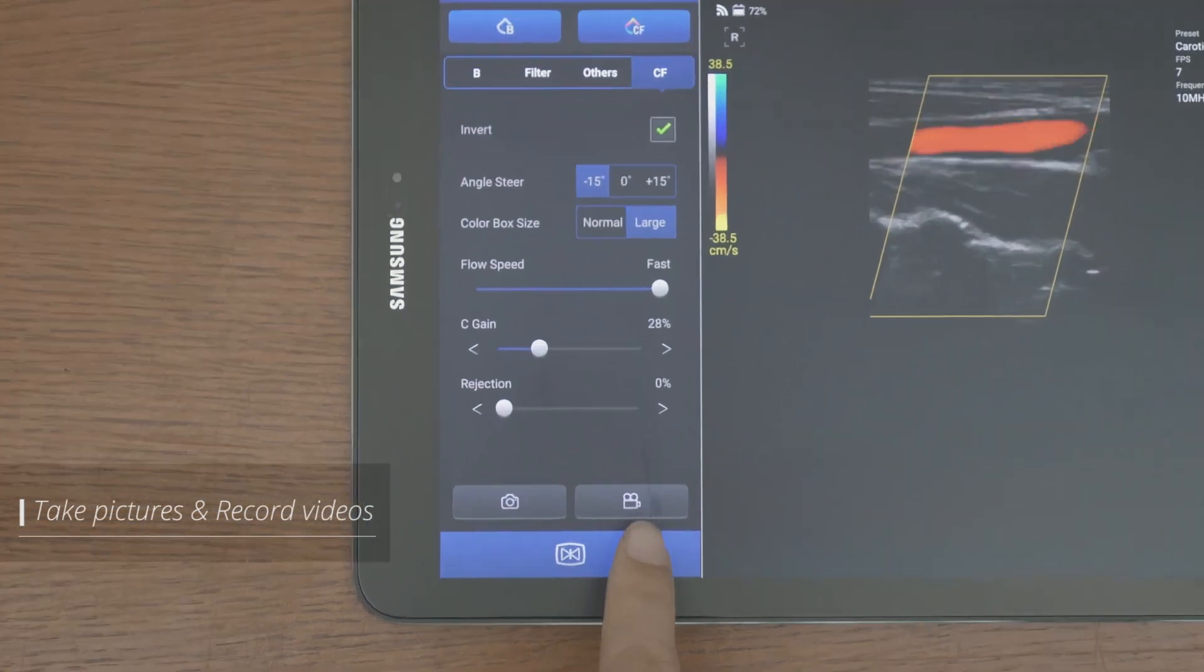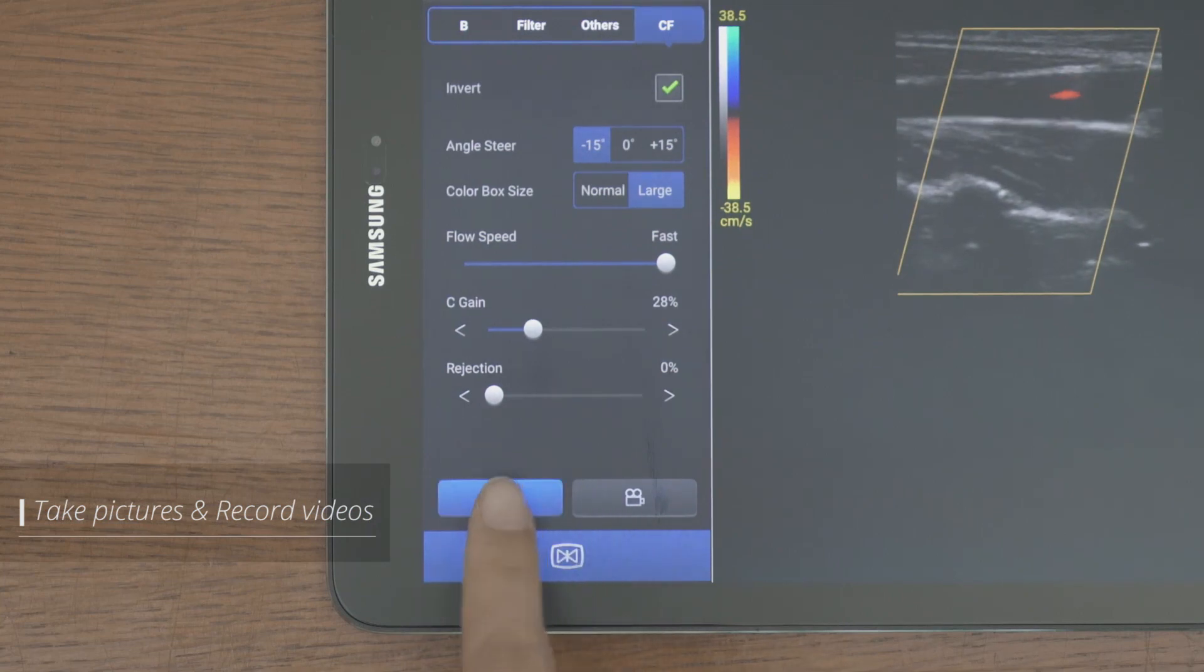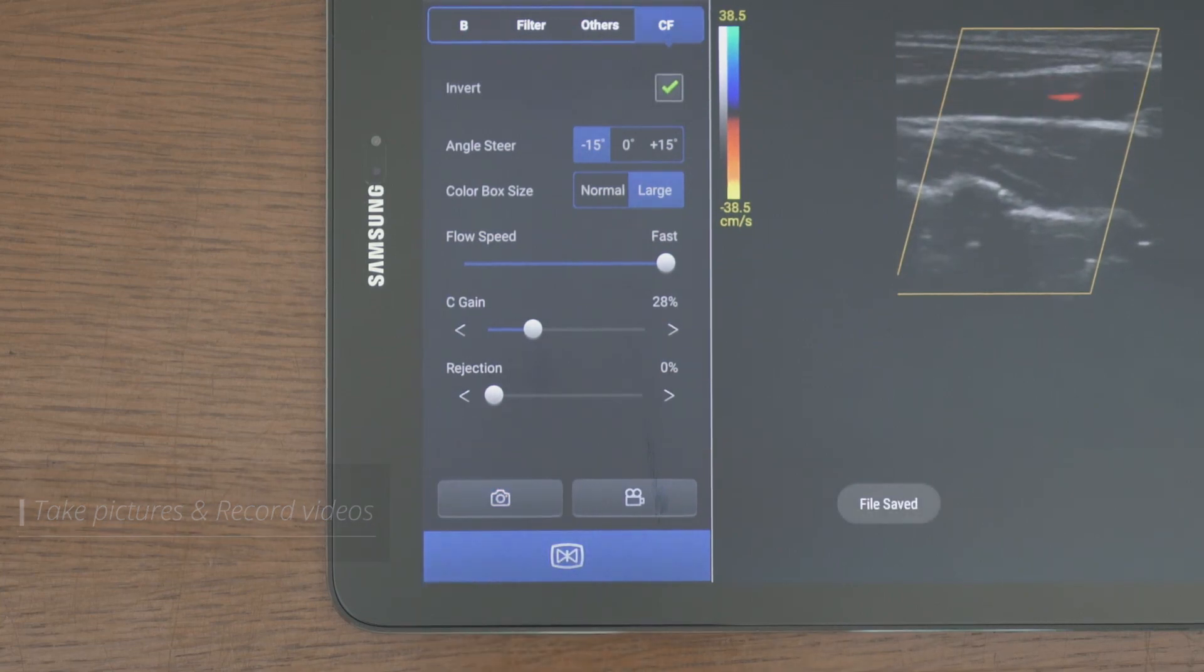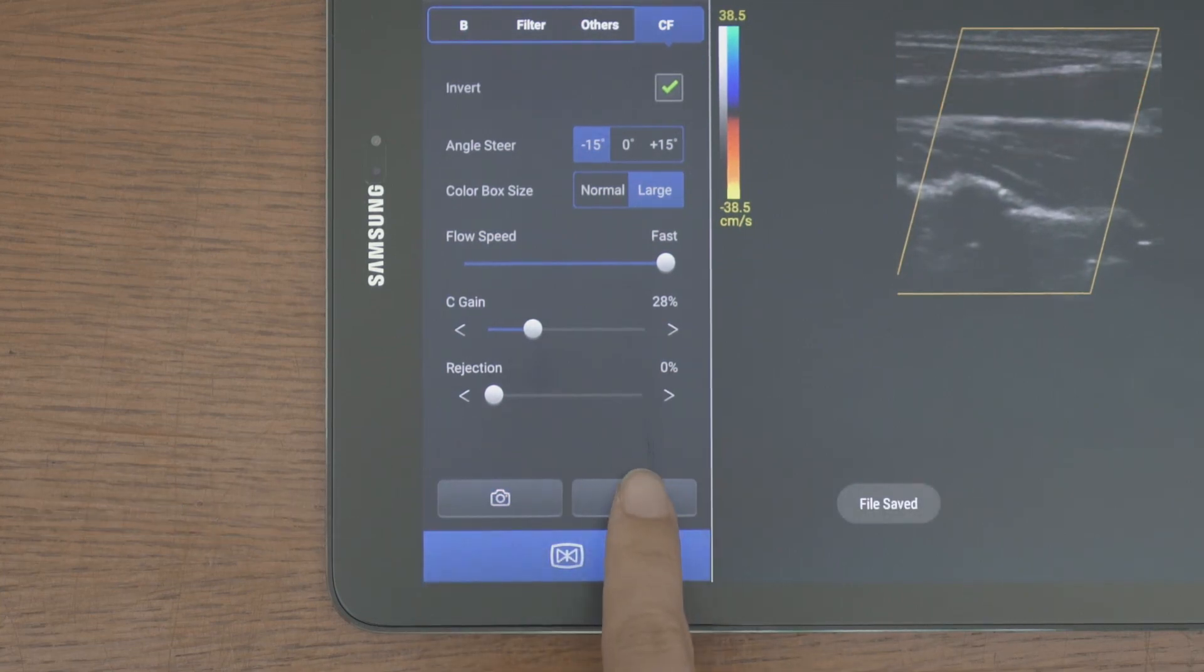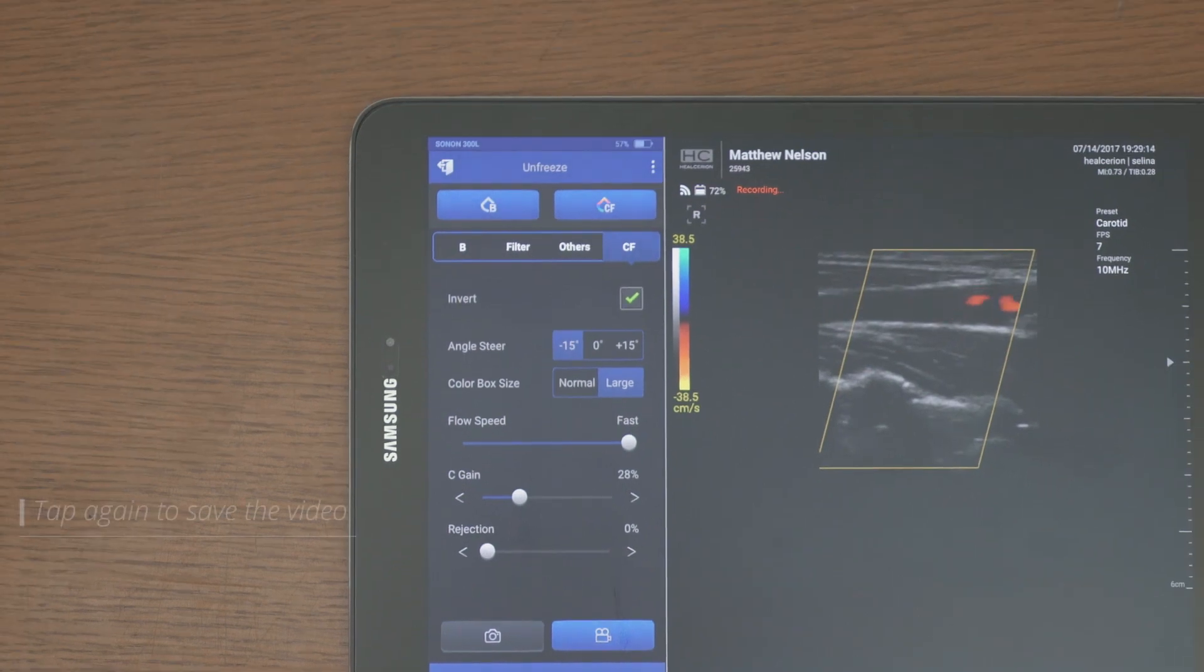You can tap the camera and video recording button on the bottom left to take pictures and record videos.